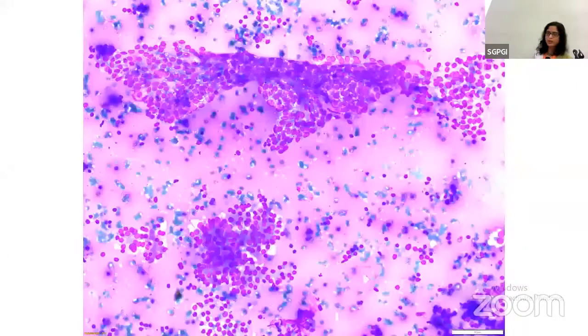So case 7. Abundant colloid, a very cellular aspirate with a lot of fragments, 3D fragments. Some of them are vascularized. And you can see what are these white zones? Scalloping and resorption vacuoles. So these were very prominent, again, abundant colloid.